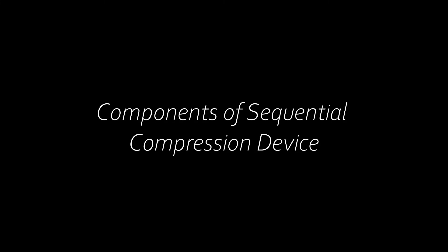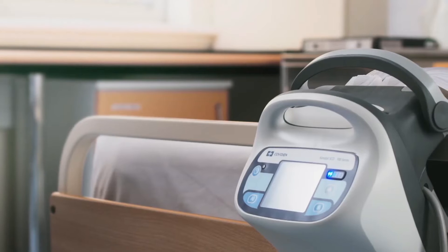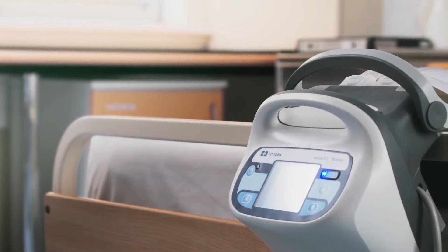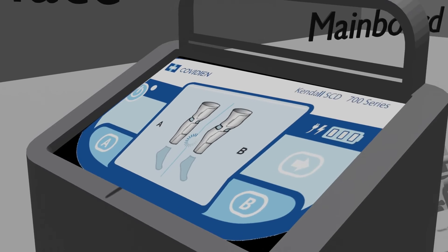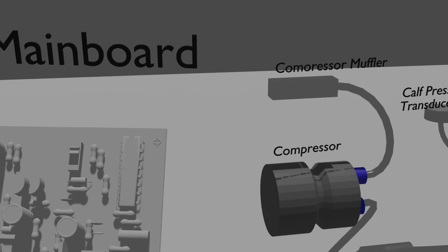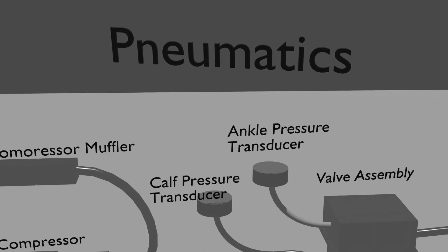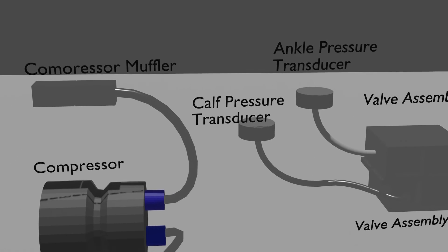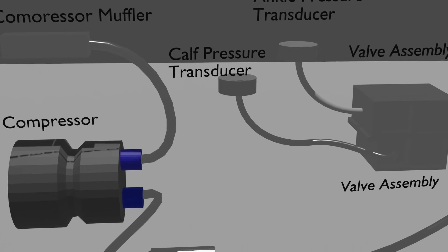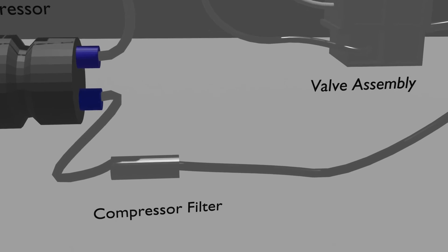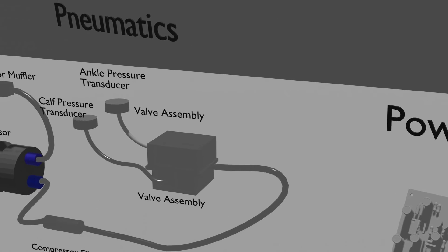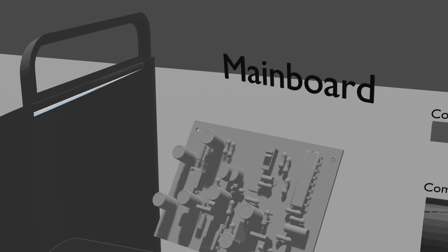Let's look into the components of sequential compression devices. The major internal components are the main PCB, pneumatics block, air compressor, and power supply. The main PCB controls the pneumatic valves and air compressor according to the settings, and controls the air pressure movement in the cuff. In the front of the device, you have a user interface panel which allows the user to control the settings. Some devices are also available with a wireless remote which can be used by the patient to adjust the settings as per their comfort.